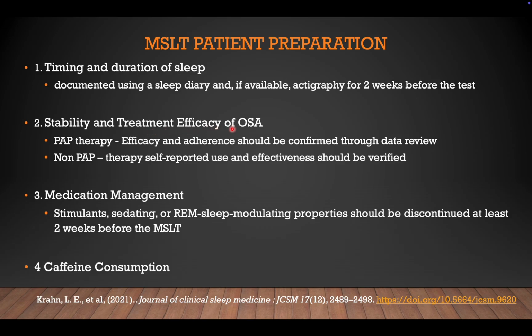If the patient has already been diagnosed with OSA, and the patient is prescribed a CPAP or a mandibular advancement device or any other form of treatment, the patient should continuously be adherent and compliant with the treatment. Otherwise, the test results will be misleading.